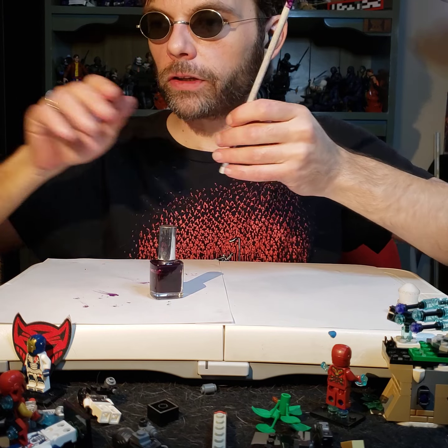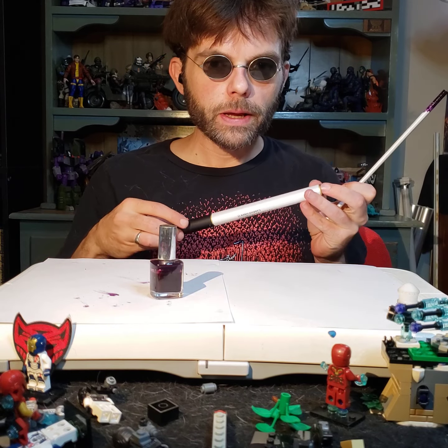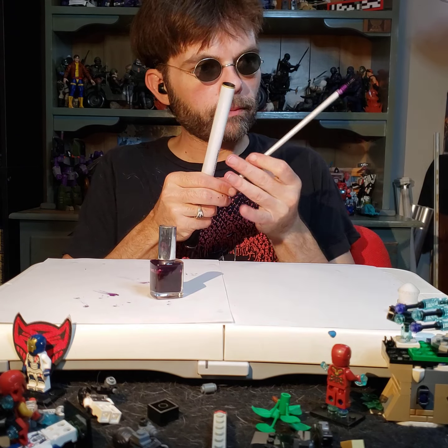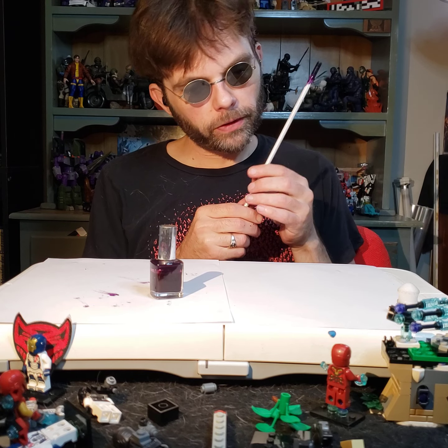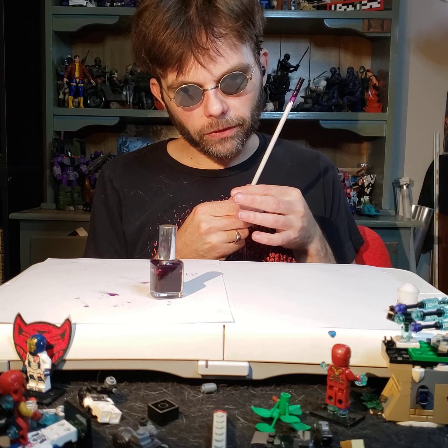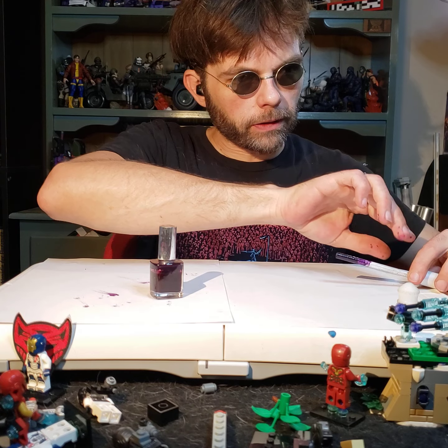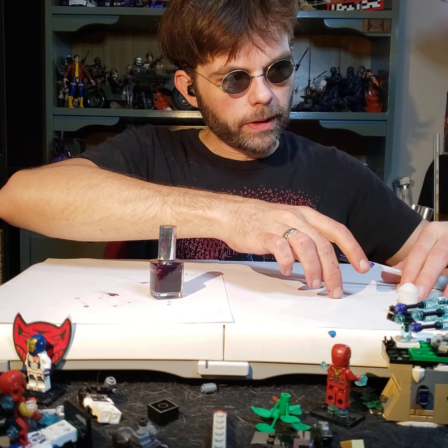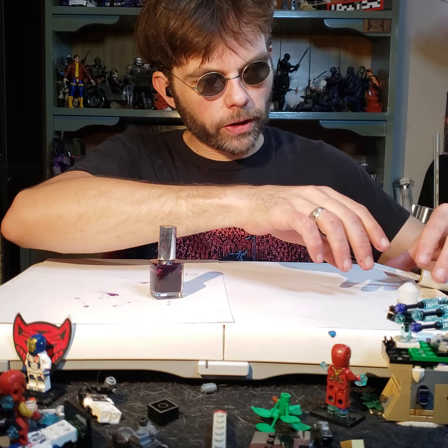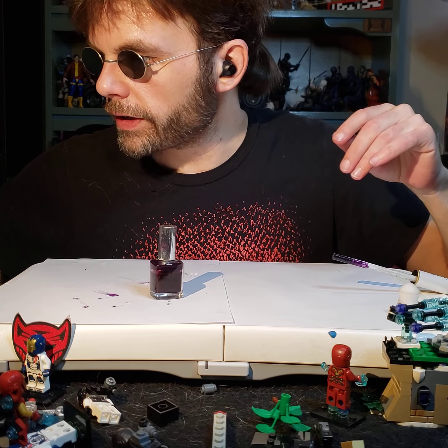All right. I think it's good. We're going to give it the test. Actually, wait a second. I could probably put this in reverse real quick and just have it sit there. Yeah, that's a good idea. I could set it in reverse style. I could set it like there. There we go. Now it's going to air dry over there so long as I don't make a mistake and hit it. That's wonderful. Now we can go over to the next one.